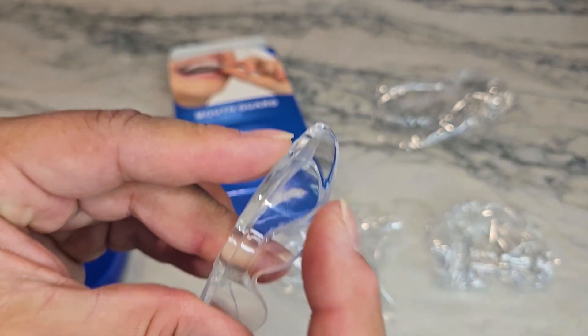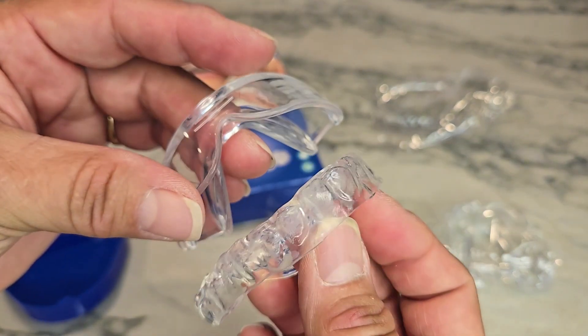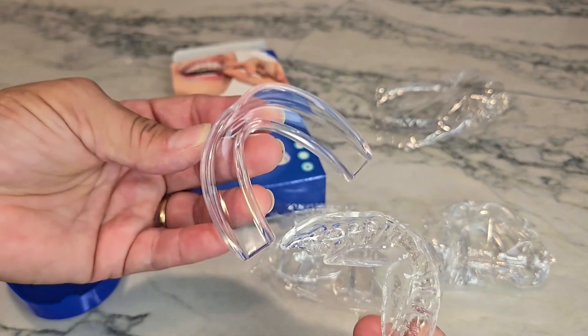Then I took a pair of scissors and cut the edge a little bit more so that I didn't have this thickness underneath my lip. Overall, it's worked really really well. If you feel like you mess up, that's okay — you have another one, you can go ahead and try it again.